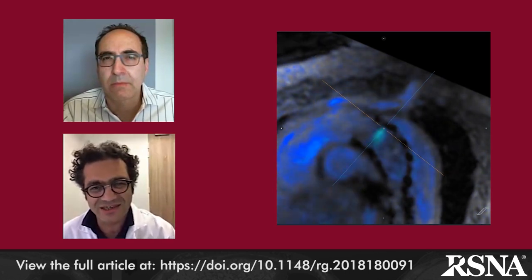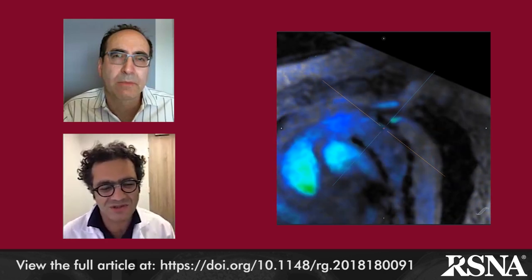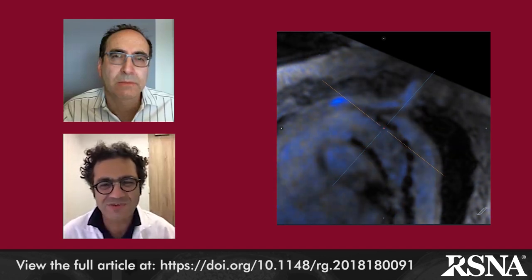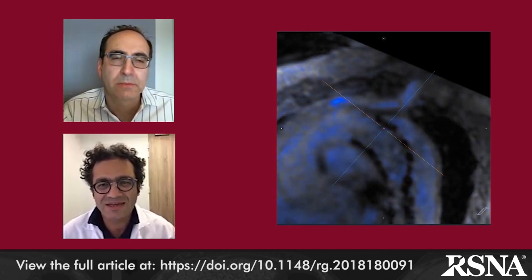It's also very interesting to see that during diastole, you have a backflow from the false lumen to the true lumen. Concerning endoprostheses, as you see, when they are in nitinol, we don't have a lot of artifacts. Also for abdominal aneurysms, you can really see the type of endoleaks and really plan the endovascular procedure after that.